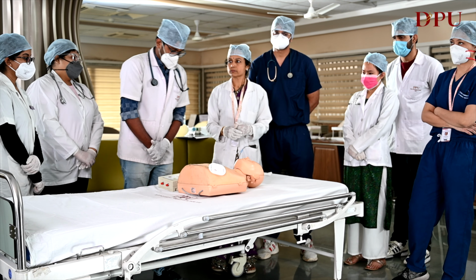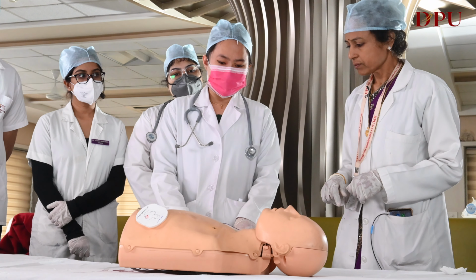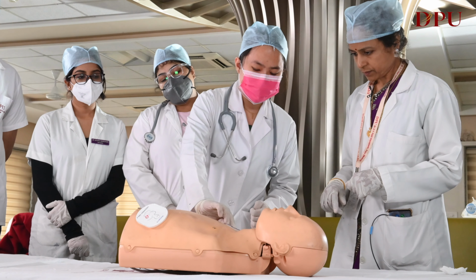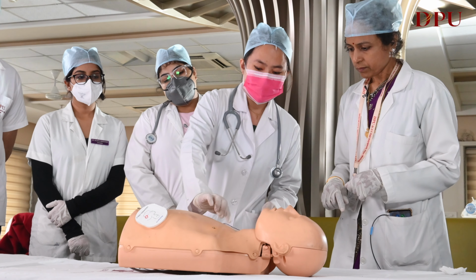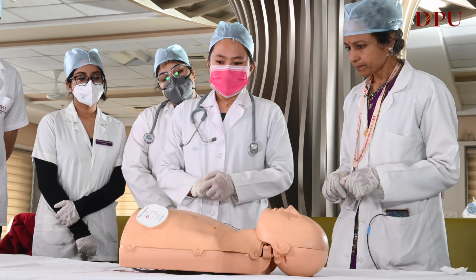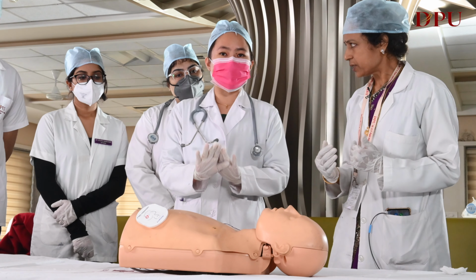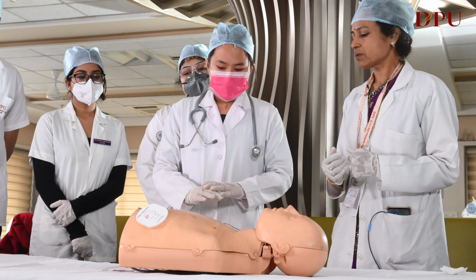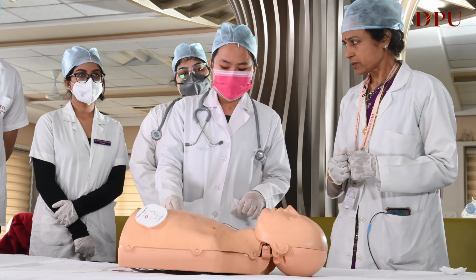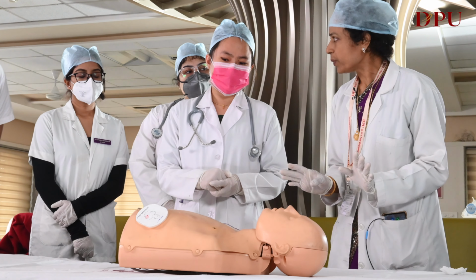This is an AED, so it consists of the on button, power on, and there are two electrodes. One pad we keep at the right infraclavicular fossa, and this is the apex of the heart. So for this, you will stop the chest compressions for analysis, and make sure that the people are far away. After that, I have to press the button. The machine will tell whether it is shockable or non-shockable.